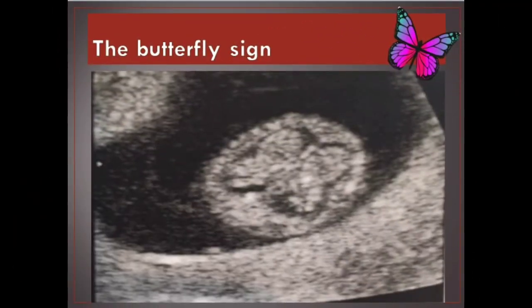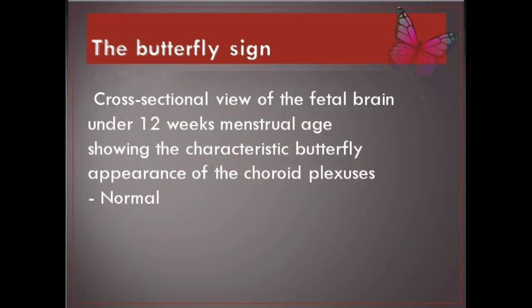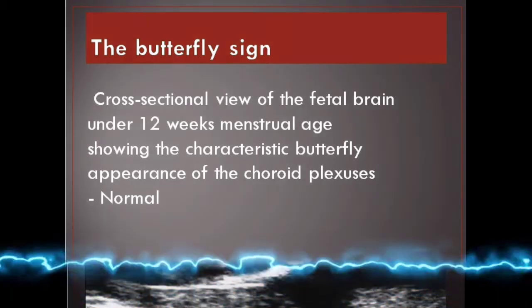The butterfly sign. Cross-sectional view of the fetal brain under 12 weeks menstrual age showing the characteristic butterfly appearance of the choroid plexuses. Normal.